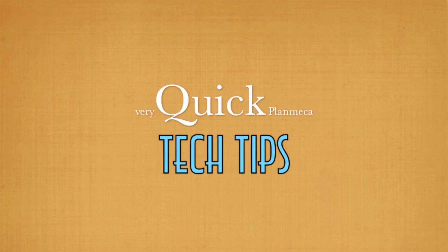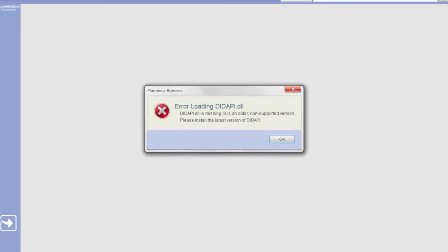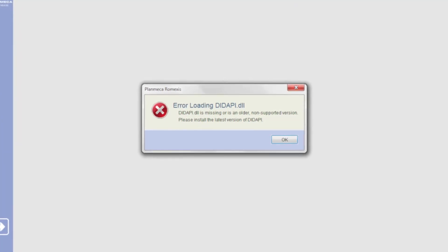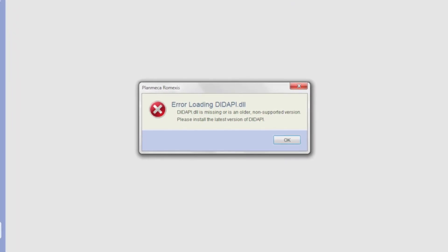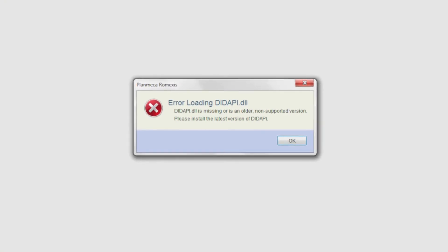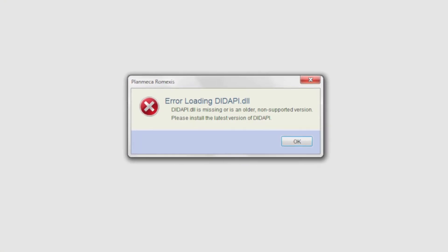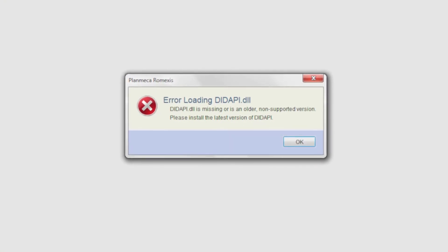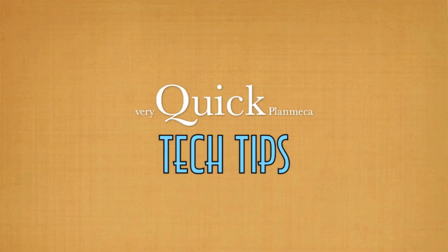Hello and welcome to another very quick PlanMecca Tech Tips. This is Cody and I'll be helping you today with the Didapi DLL error that you get upon Romexis startup. This error is the computer's way of telling you that you don't have Didapi installed on the computer.